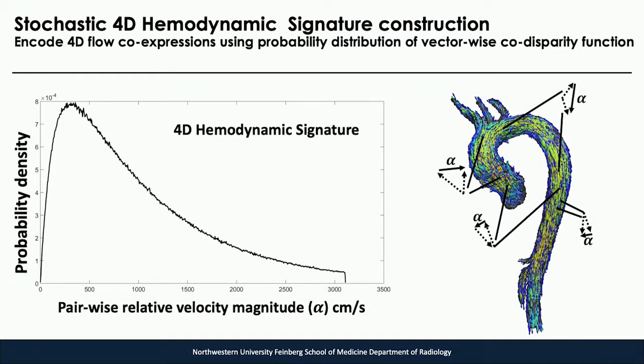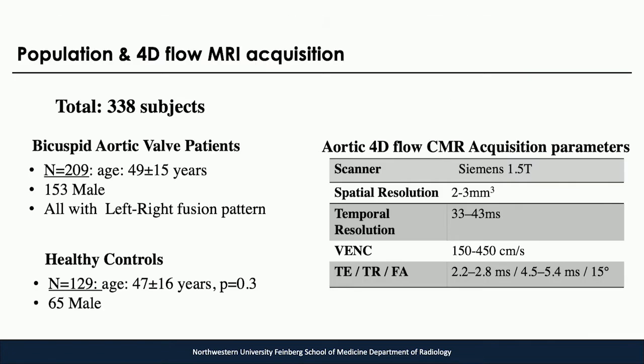And so the method used here to develop this metric, or this velocity signature, is to randomly sample 2 points in space and time and compute the vector difference in the velocities. Then we can compute the magnitude of this vector, and we can perform the sampling many, many times and compute a probability density function like shown here. And this allows us to work directly with the vectors.